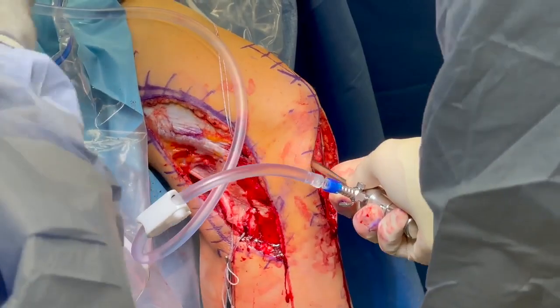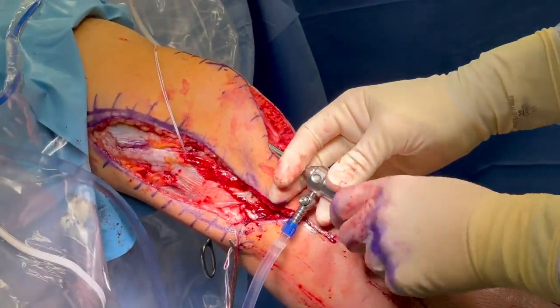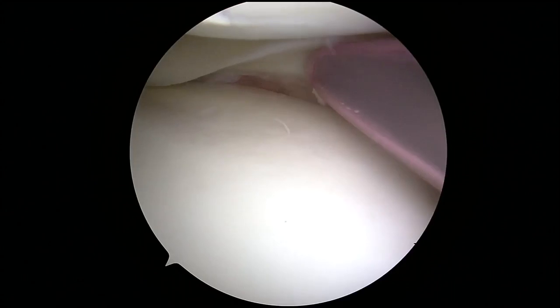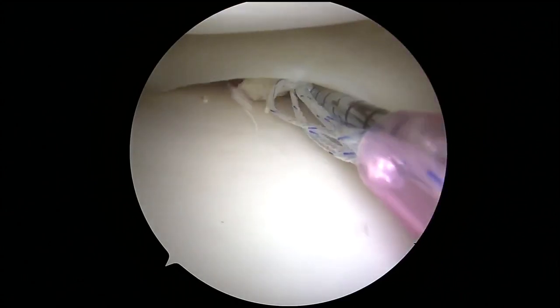Medial and lateral peripatellar portals are made and the joint is insufflated with saline. This patient has a medial meniscus ramp tear at the meniscotibial junction. This is repaired with an all-inside technique using two FastFix Flex sutures.